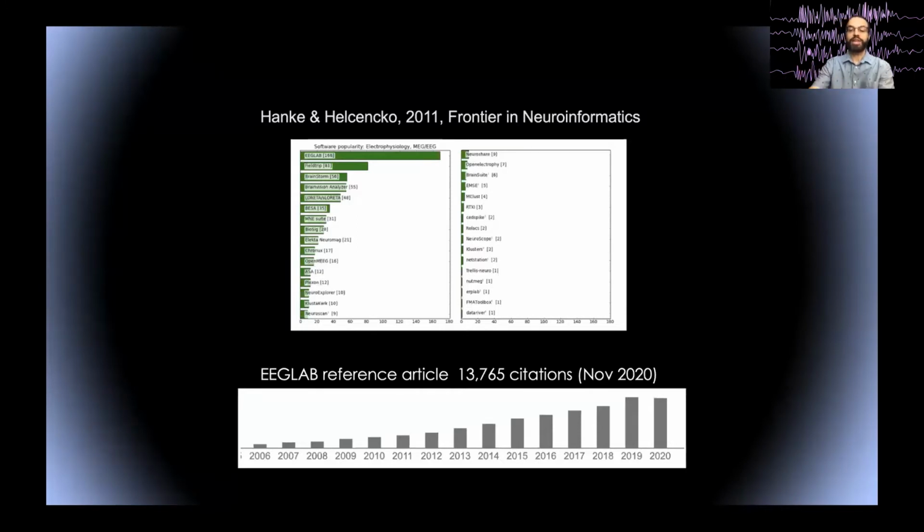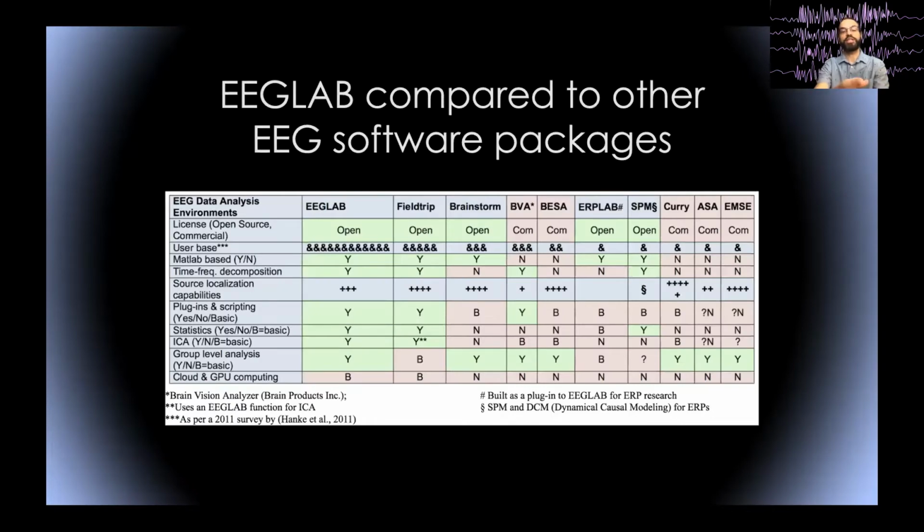And you might say, well, now there are other tools, so what's the advantage of using EEGLAB?